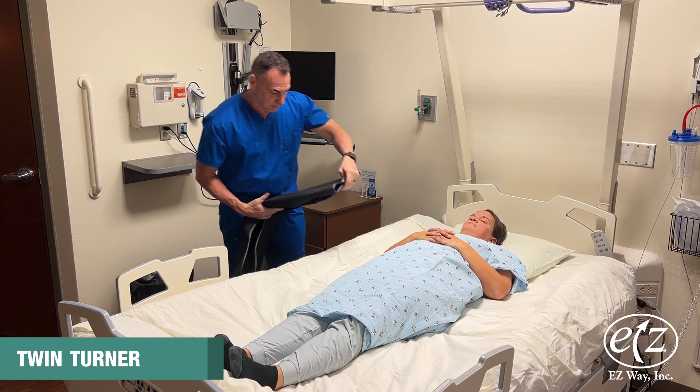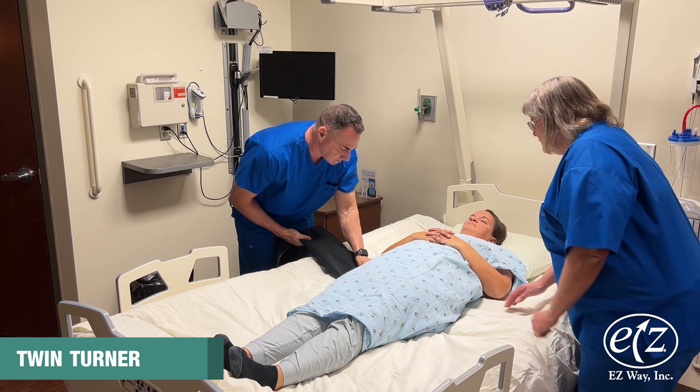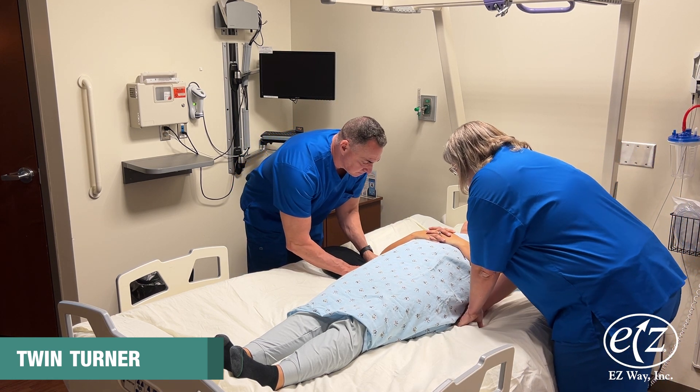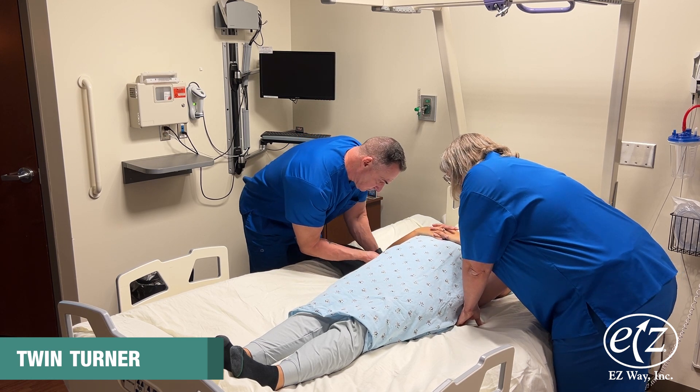Place your hand palm down onto the bed and on top of the folded portion, and slide the folded portion of the sling under the small of the person's back.